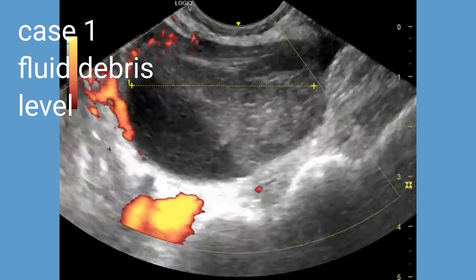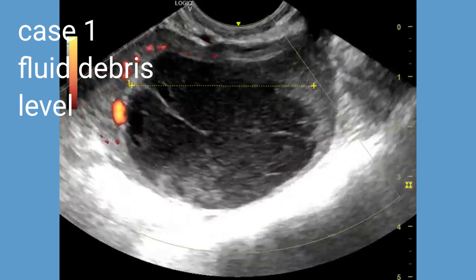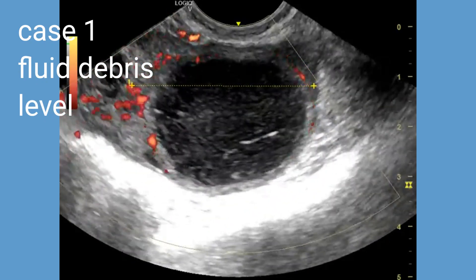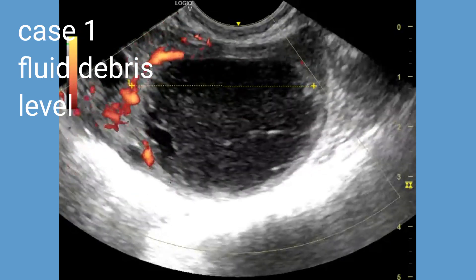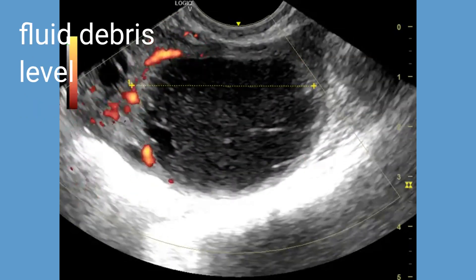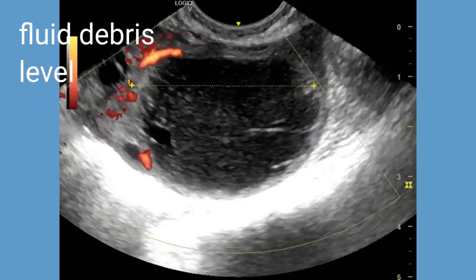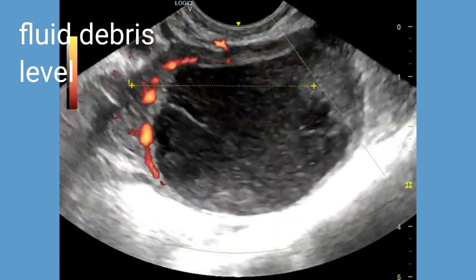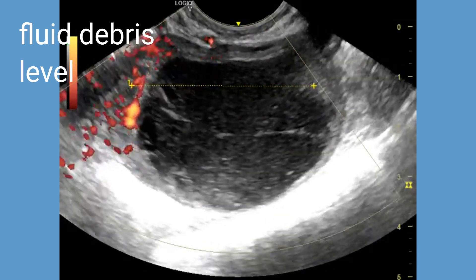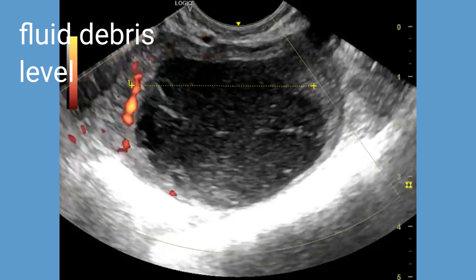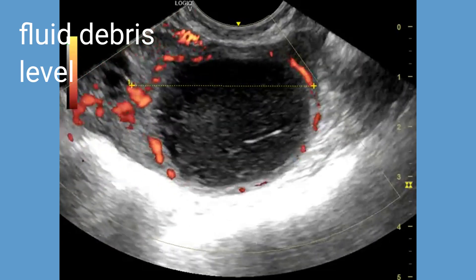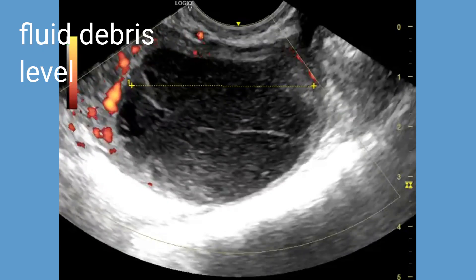Detecting a fluid debris level can be a distinct feature of a hemorrhagic cyst and can aid in its diagnosis when using ultrasound imaging. Color Doppler or Power Doppler ultrasound in this case show no evidence of internal vascularity, and there is presence of a rim of vessels surrounding the hemorrhagic ovarian cyst.